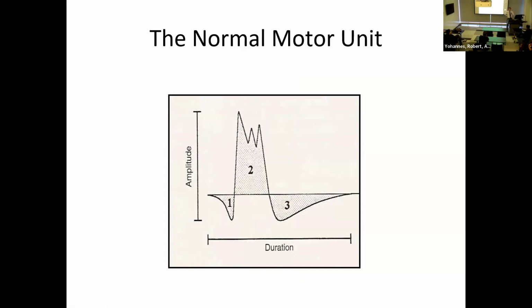But you will see in books that phases, so the correct definition of a phase is when it crosses the baseline here. You see on top here, there are also deflections, which we didn't see earlier. This is a bit abnormal, but not abnormal enough to actually get the name of a phase. So you see the numbers here, we have 1, 2, and 3.